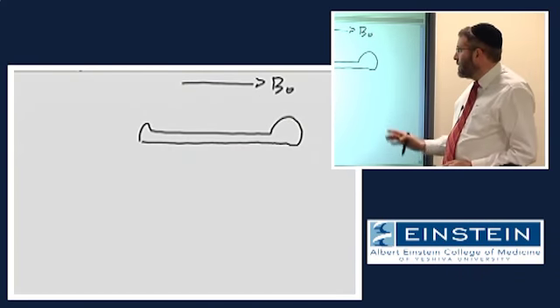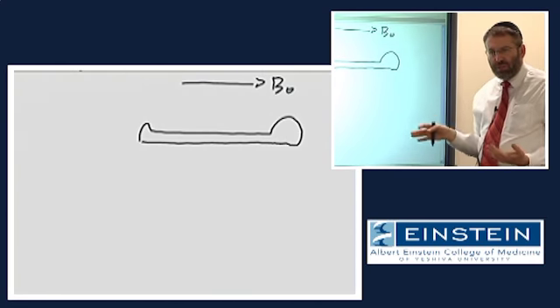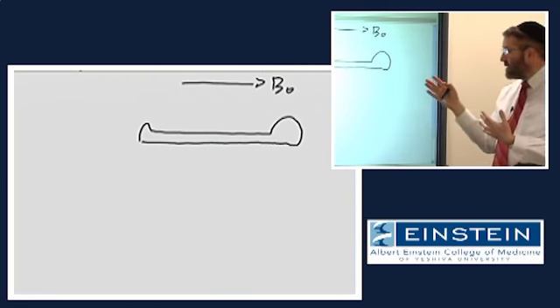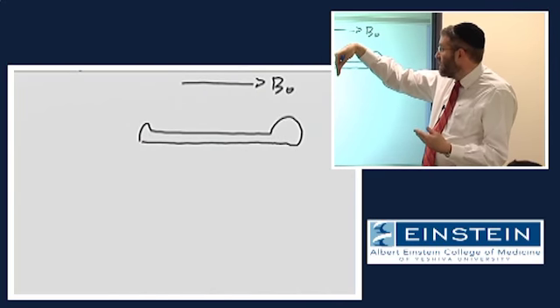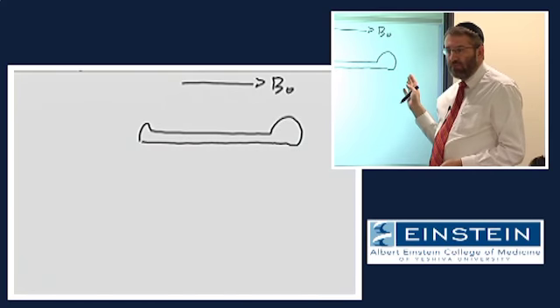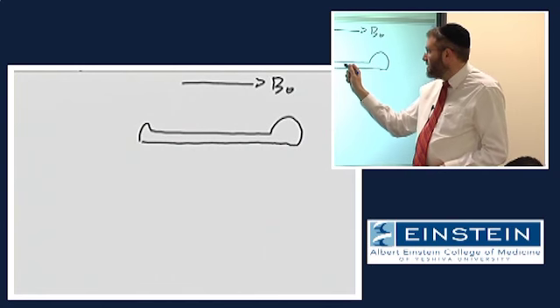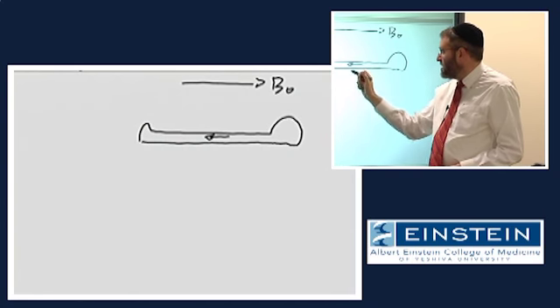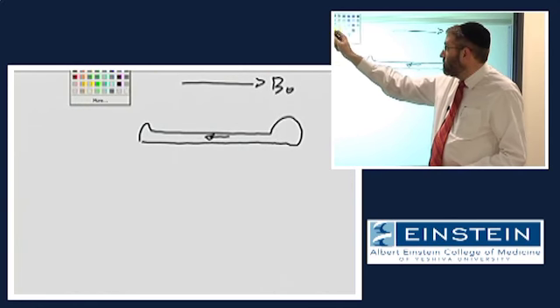So in the presence of this homogeneous static magnetic field, we just said that if we tilt the magnetization in the patient into the transverse plane, we are going to be detecting signal from the entire body. Now, what did it take to make this magnetization tip into that transverse plane?